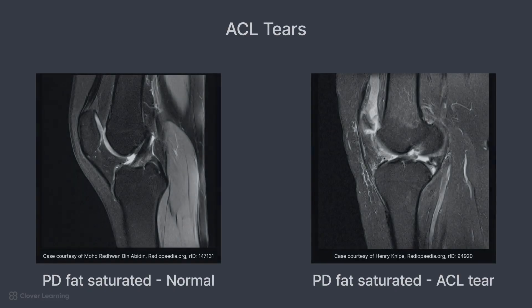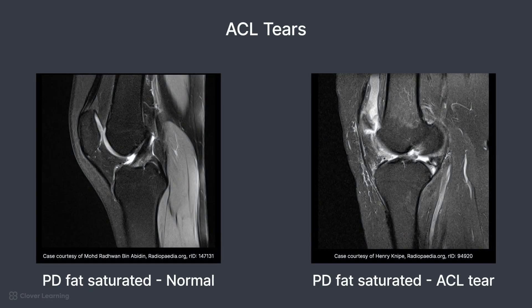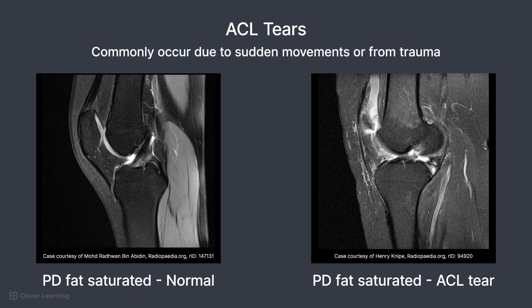Now let's look at the anterior cruciate ligament, or ACL. ACL tears commonly occur during sports involving pivoting or sudden stops like soccer or basketball, or from direct trauma. On MRI, a normal ACL appears as a low-signal diagonal band connecting the femur to the tibia on sagittal images. Tears manifest as discontinuity or high signal disruption on T2 or PD-weighted images, often with bone bruising in the lateral femoral condyle or tibial plateau.